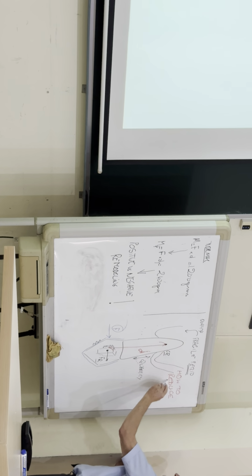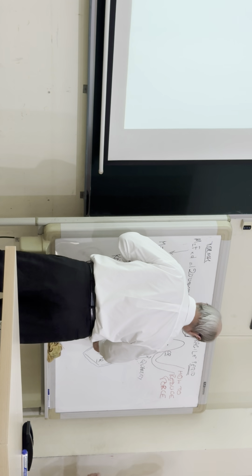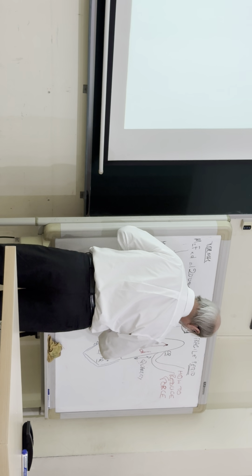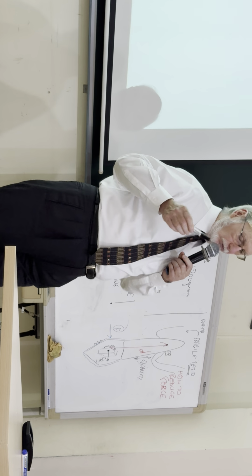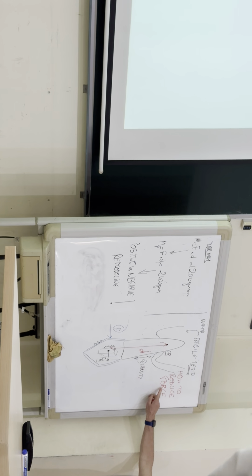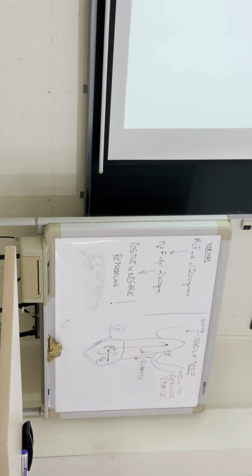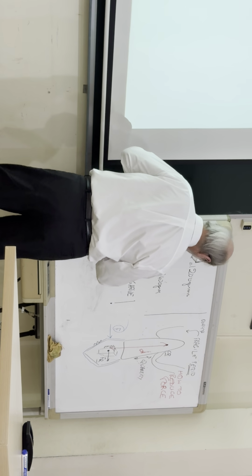Yeah. So the only thing you can do is to make big attachments to create a lot of moments and reduce the force. The problem in aligner therapy is that we use displacement driven. So the force application is almost proportional to the displacement, to the number of stages you put. So if you have a perio patient, you have to put more stages and try to cover as much crown as possible. This way, you're going to drive the crown, and what you have is what we call positive remodeling.